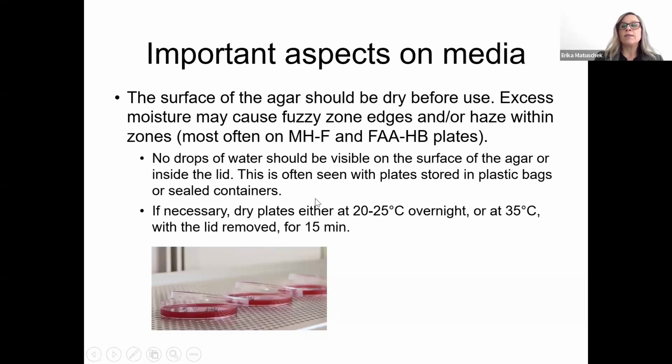So what you can do is that when you have stored your plates in the fridge, they should always reach room temperature before you inoculate them. When they have reached room temperature, you can open the plate and make sure that you do not have any drops of water on the agar surface or inside the lid. If you have that, you should probably dry the plates.